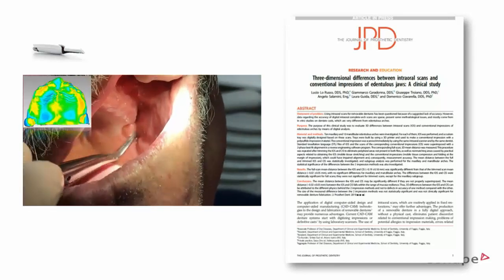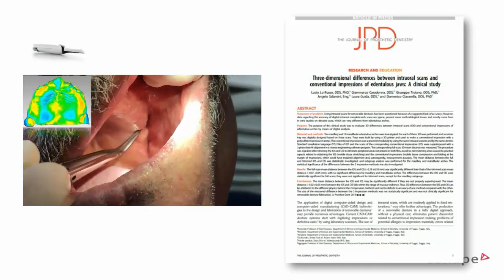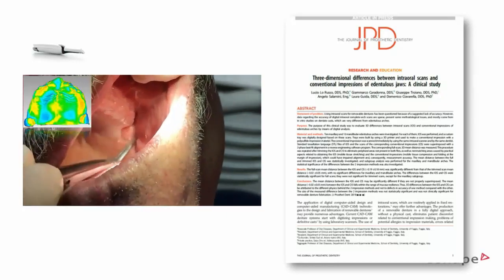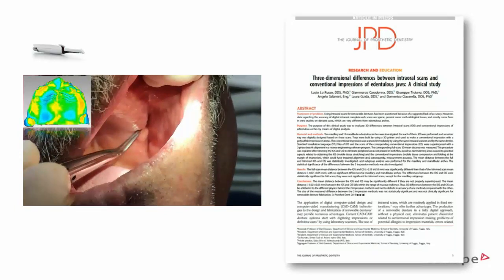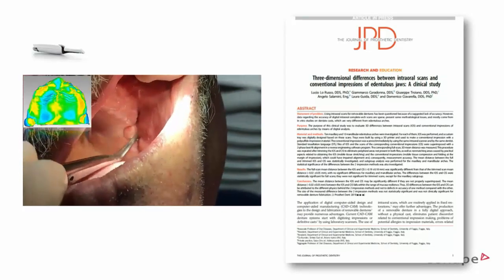And it's proven also, with Lucio doing more than 400 dentures, that the digital dentures are working with great clinical results. He also presented at IDDS in Atlanta as one of the keynote speakers, and he got a lot of positive reviews, a lot of people asking him exactly how he scans.